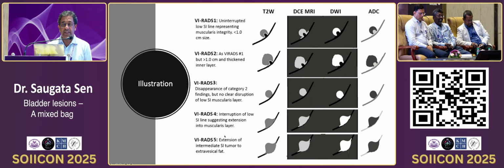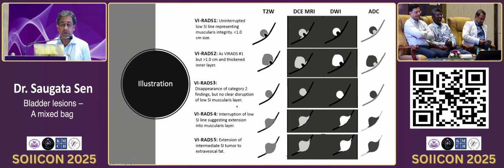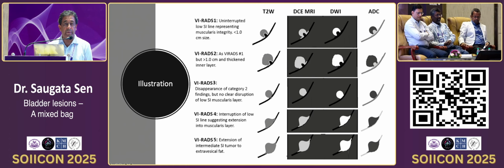4 and 5 are very simple and easy to remember. 5 has gone outside the bladder wall and 4 is involving the bladder wall but has not gone outside. The problem always is with the 3. And here is the disappearance of category 2 findings but no clear disruption of the low signal intensity muscularis area. So this is a really problematic area.